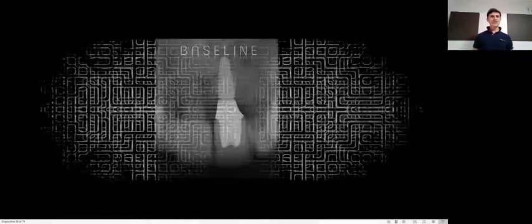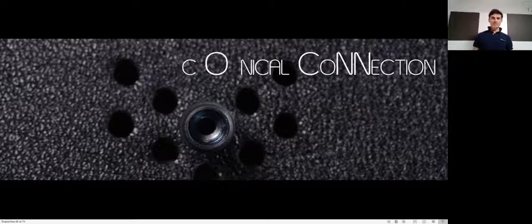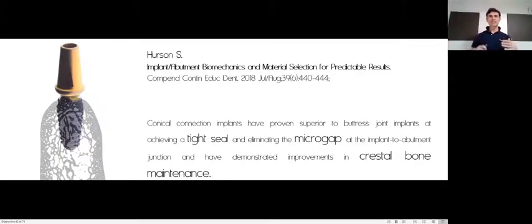The situation from a radiographic status at baseline with a good representation of the implant orientation from apical to coronal with the 2 millimeter subcrestal positioning of the fixture, and we were very safe because a good internal conical connection of this enriched implant was provided for. And we know that this kind of internal conical connection is the key point to maintain the stability of peri-implant tissues.